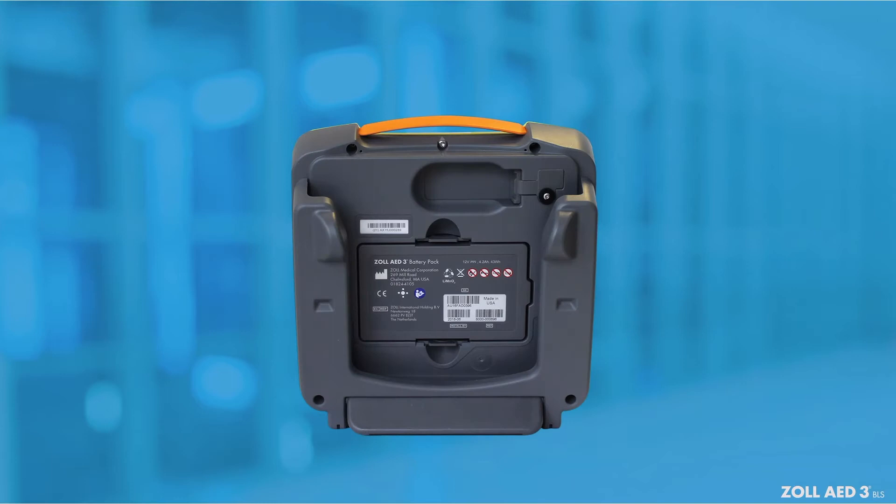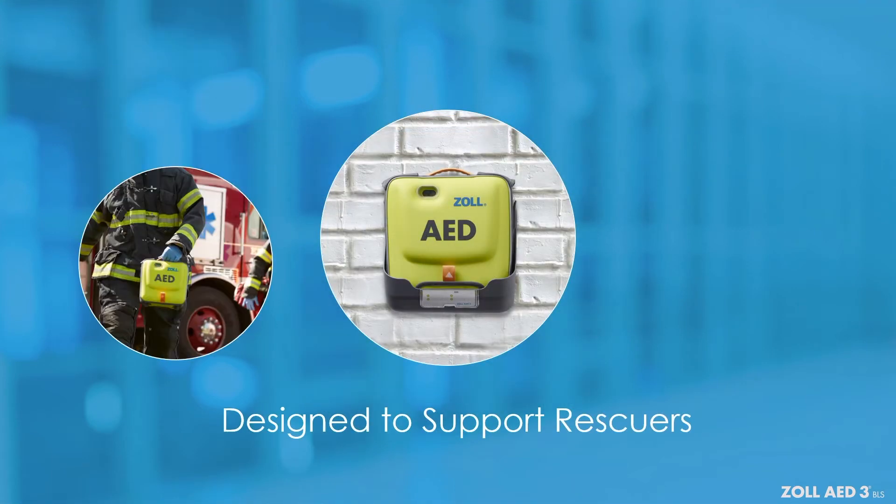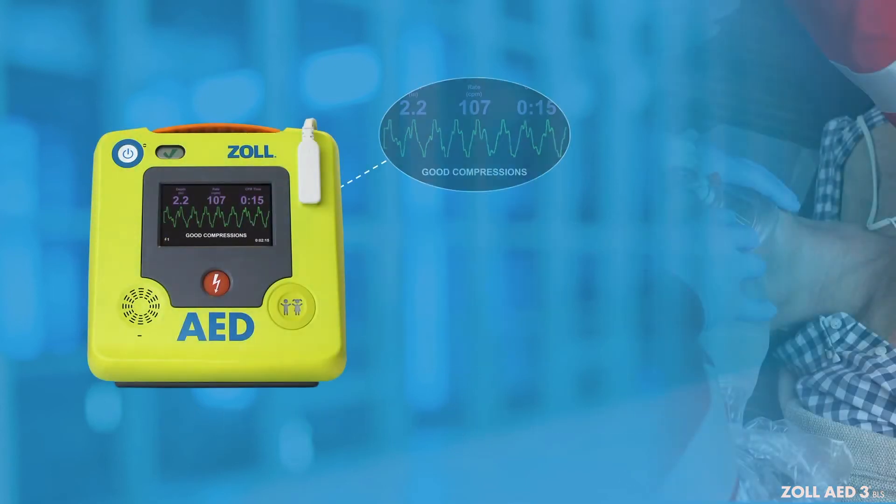The Zoll AED-3 BLS is designed to support trained BLS first responders and professional rescuers during and after a rescue. From real-time feedback on the compression quality to post-event debriefing, the Zoll AED-3 BLS provides guidance to help save lives.